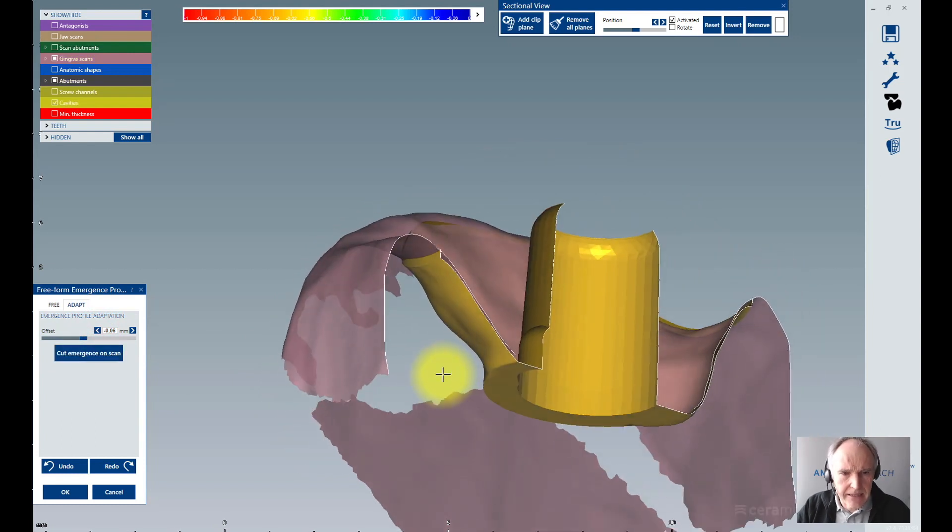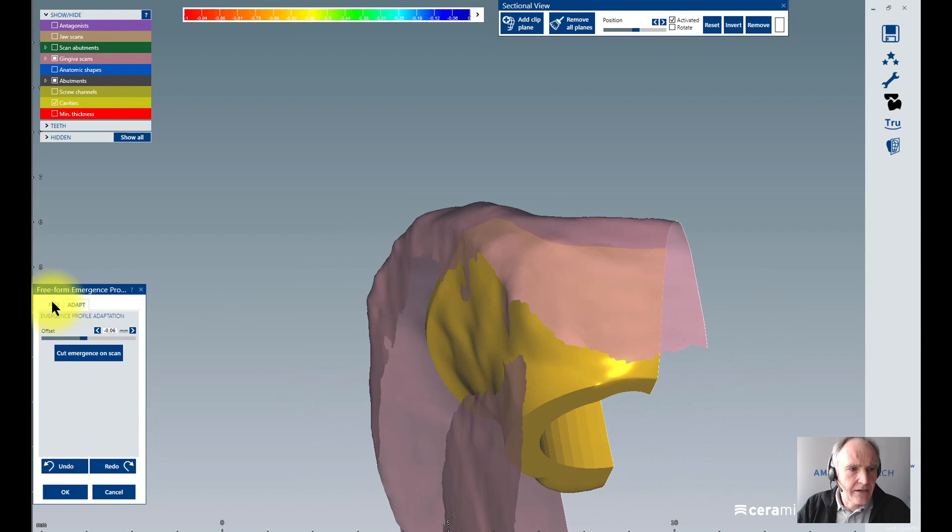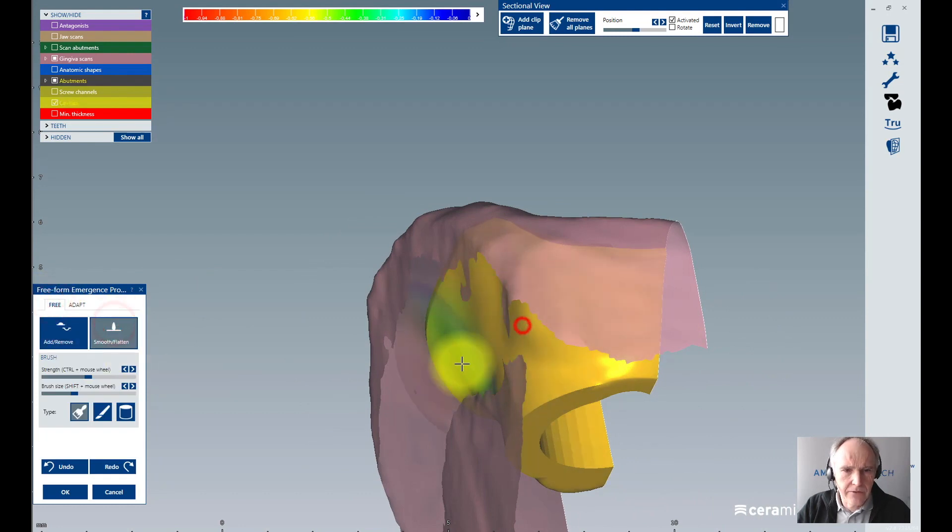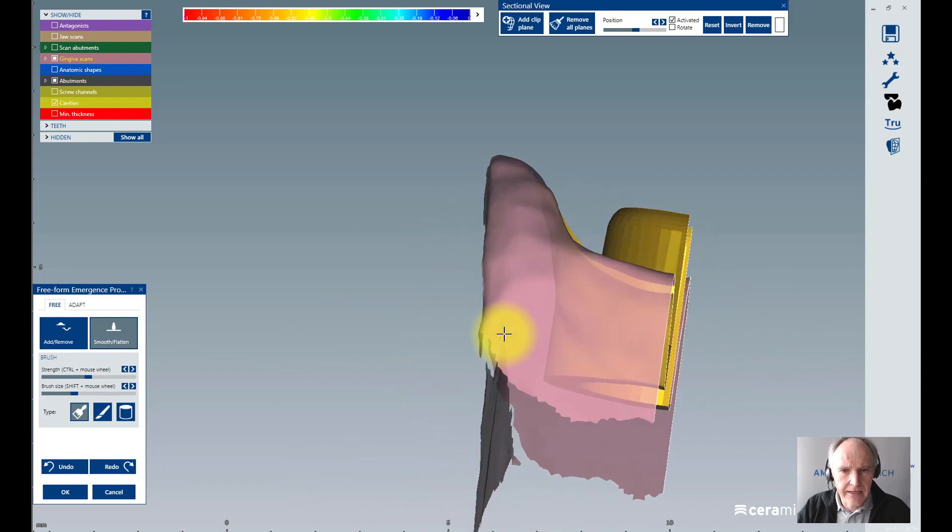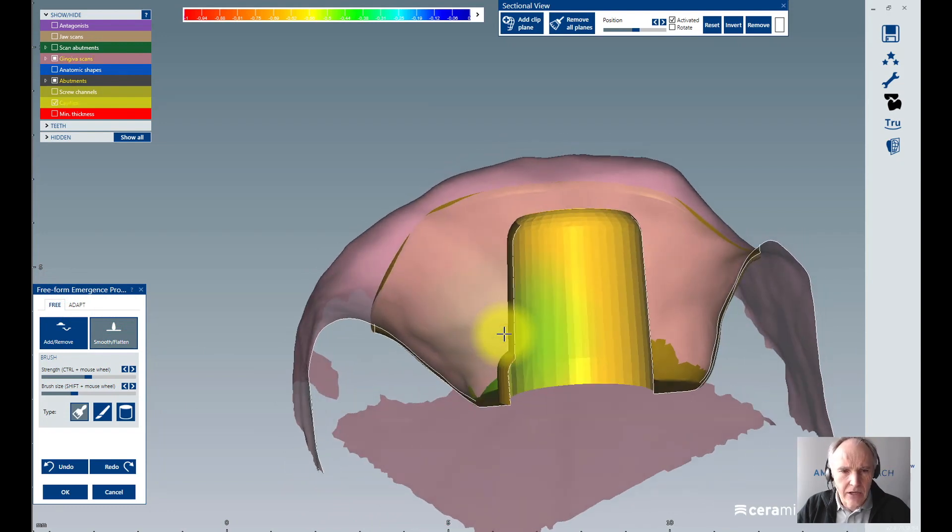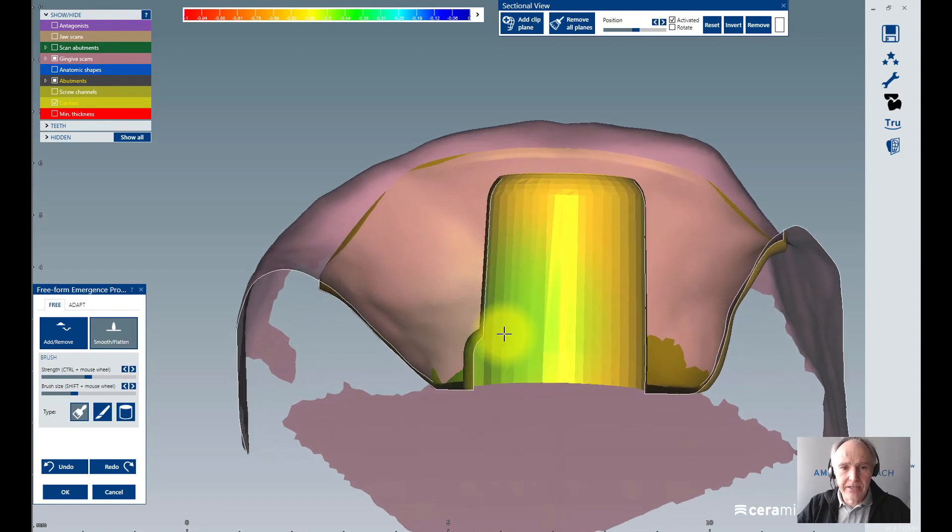After that fitting, I can go to flatten, to smooth, and to add or remove material if I feel it necessary to add more material or to remove material. That's it - the small trick to get the best fitting between your abutment and your gingiva.